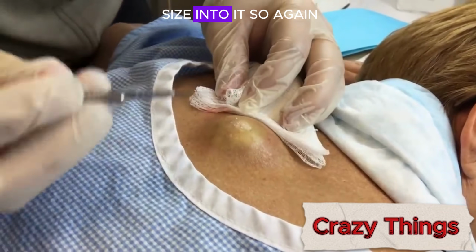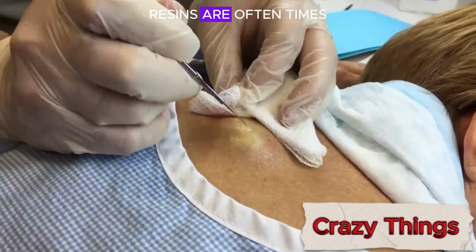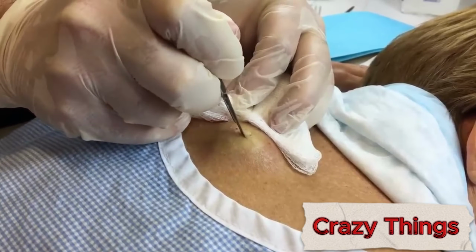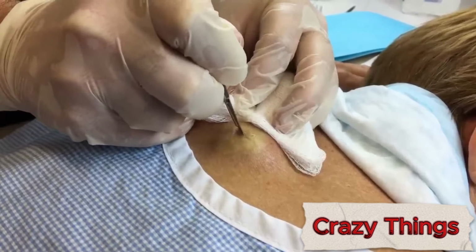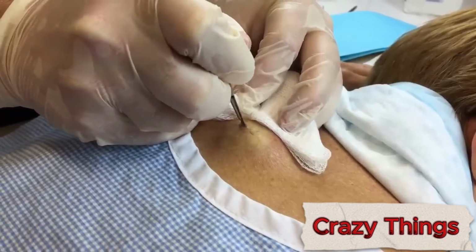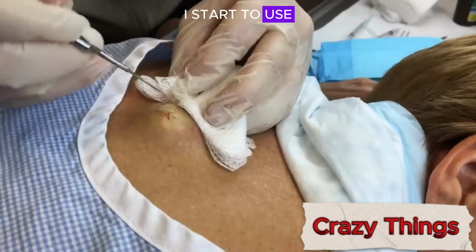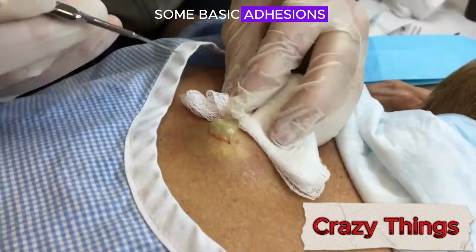So now we're going to cut into it. So again, this is a number 11 blade. And you have to be careful. Again, residents are oftentimes right over top of this, and if you are, you can splash yourself. You're okay? So you notice with the blade, I start to use an angled approach. So I use the blade to break down some basic adhesions.